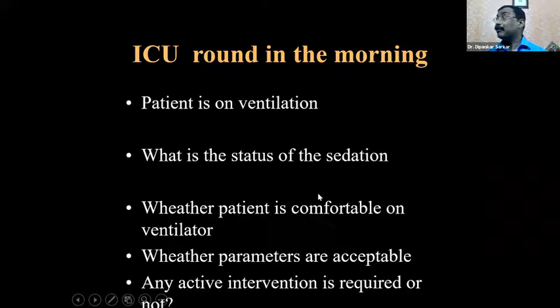So we are in the ICU round, and the patient is on ventilation. Take a hypothetical situation. Many of you have been on the morning round today in your ICU and found the patient on ventilation. The first thing you see is the status of sedation. Is the patient awake or still sleeping? Is the patient comfortable on the ventilator, or fighting with the ventilator, or trying to communicate with the consultant on round and the healthcare team associated in his or her care?